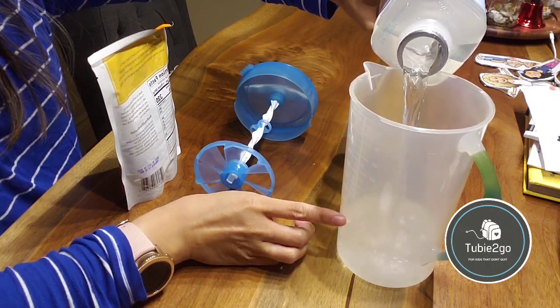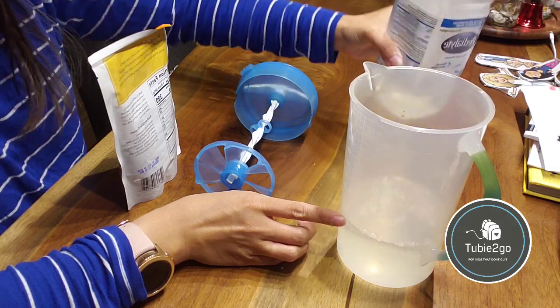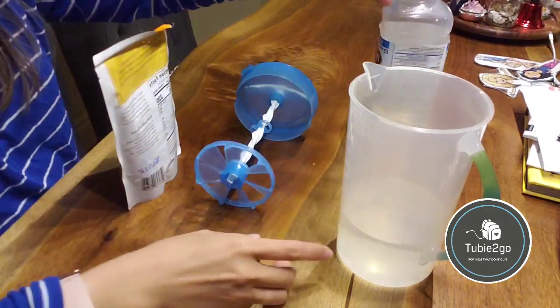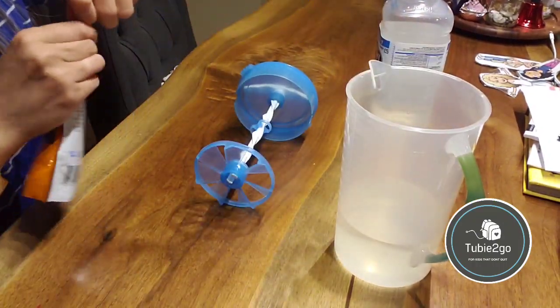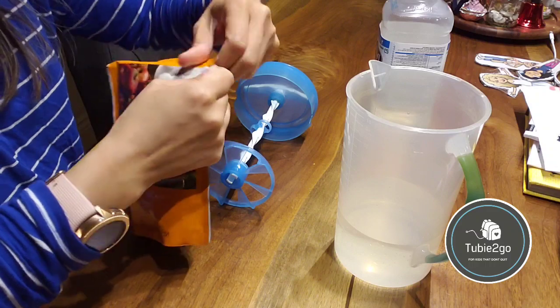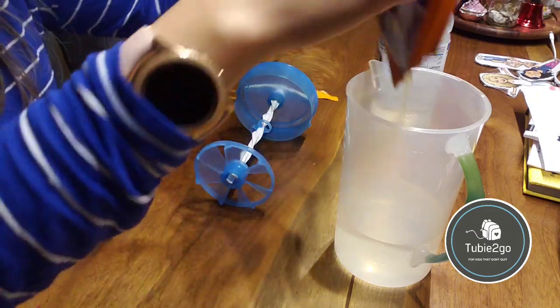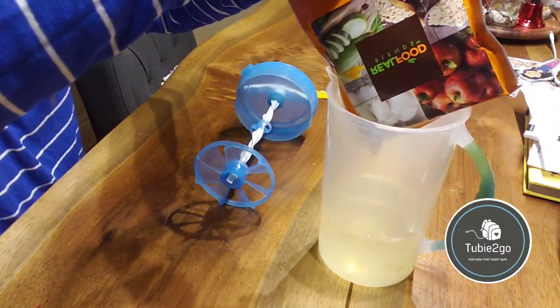There are graduated marks on the side of the pitcher that tell you the volume. My only complaint is that they are transparent — the same color as the jug — so it's a little hard to see. I sometimes mark it off with a Sharpie just so I know where I'm pouring to.